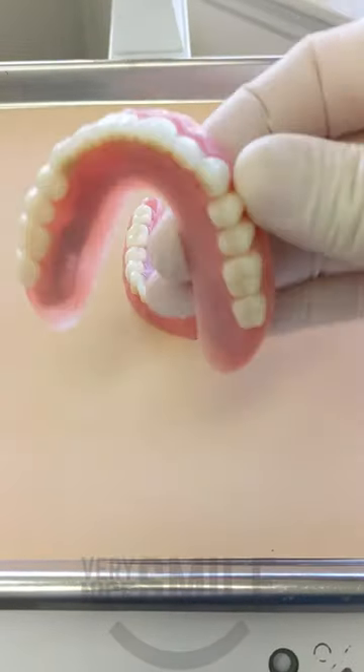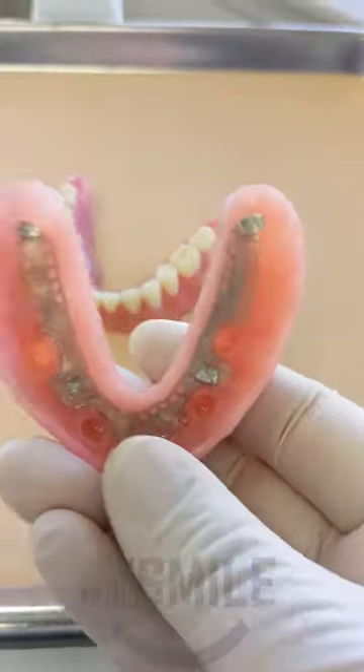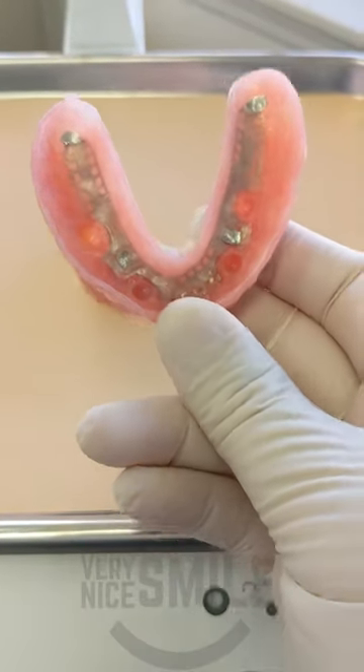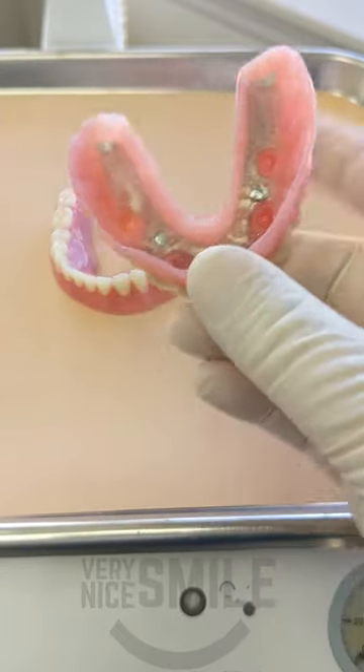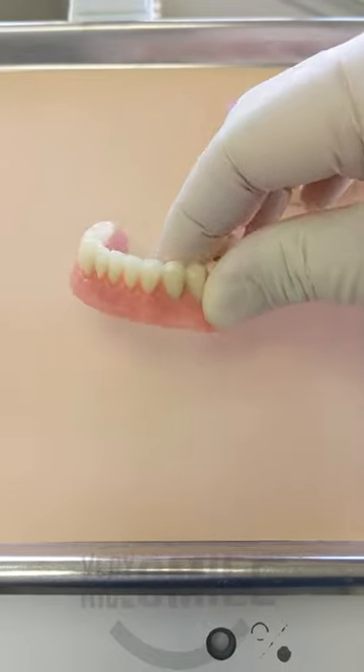Dr. Rich here with a set of upper and lower final overdentures. As you can see, the upper is a palate-less overdenture. There's a better view of the metal framework inside. I haven't delivered this yet, so there's no locator clips or snaps inside of it.